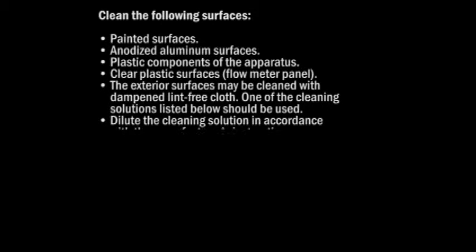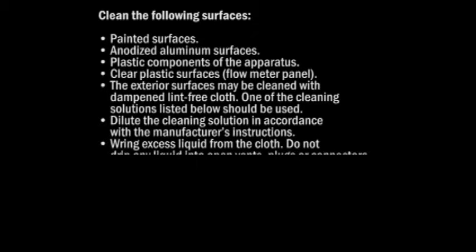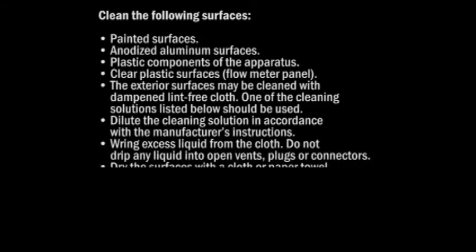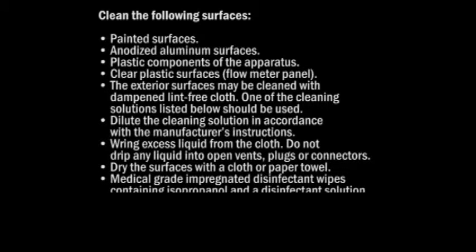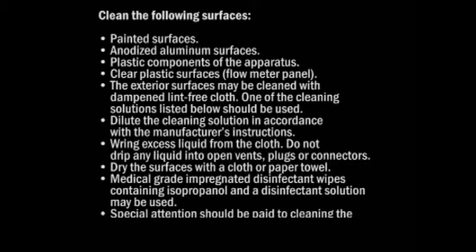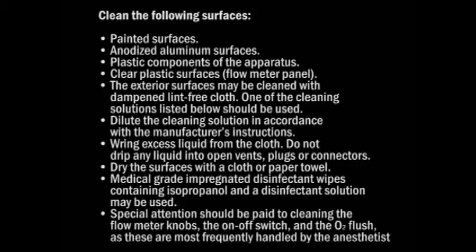One of the cleaning solutions listed below should be used. Dilute the cleaning solution in accordance with the manufacturer's instructions. Wring excess liquid from the cloth. Do not drip any liquid into open vents, plugs, or connectors. Dry the surfaces with a cloth or paper towel.